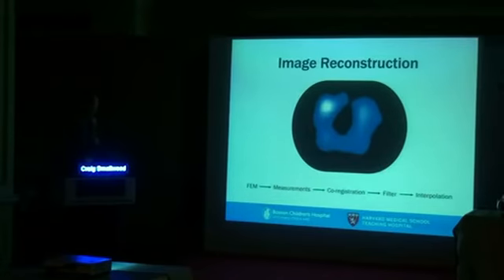But the key, I think, is that this looks really smooth and really quite beautiful, but it's almost lying to you a little bit, because we looked at that very first image with the triangles. That's the actual raw data. And everything since then was just a number of mechanisms to filter, to co-register, and then average the lung image.